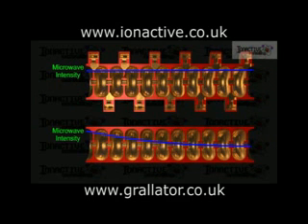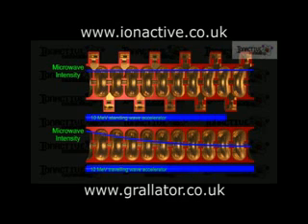Because of this, a standing wave accelerator gives a higher acceleration per unit length, and so can produce an accelerator that is shorter than the equivalent travelling wave design for a given energy gain. However, as the power is uniform down the guide, it requires a higher power microwave, magnetron or klystron to drive it for a given beam power.